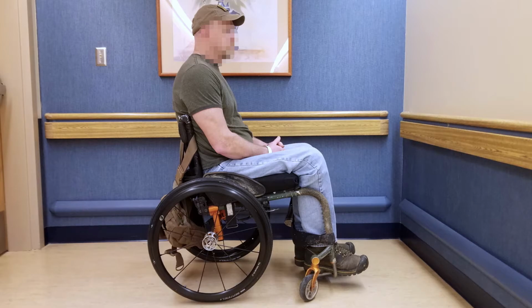But when you have these very low-level injuries, they tend to prefer very low backs. But if they're sitting on a seat slope and they don't have any real back support, how many of us would be comfortable sitting in an office chair that was slanted like that all the time? And hardware is not exactly as good as the human body structures before the surgery. So might we want to be thinking about giving them a limited amount of support in the back, and also to allow them to have a posteriorly oriented posture so they can relax.